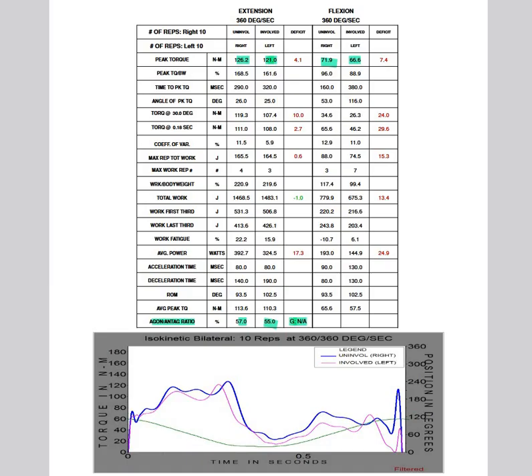So these two HQ ratios we have here are worth noting and are certainly something that I would document if I was looking at this data. They are low. They are very low. These should be much higher, in the 80-90% region. And if you want a layman's interpretation of how to explain this, what this 57% is saying is that the hamstrings are 57% as strong as the quadriceps.